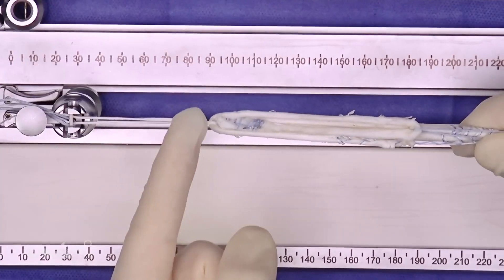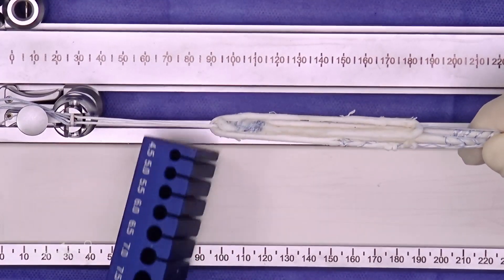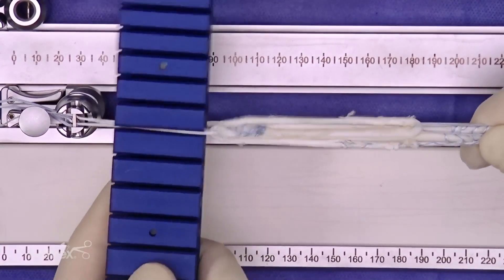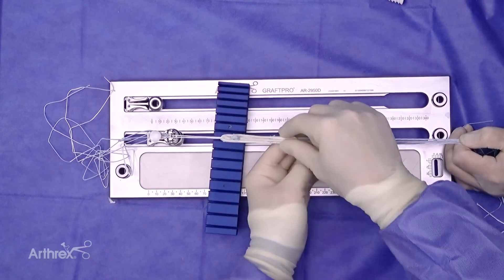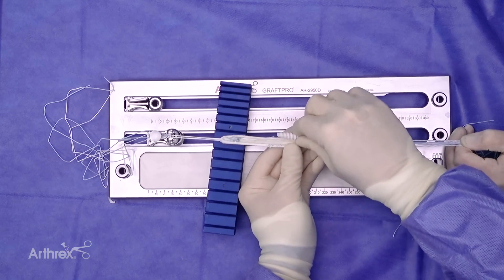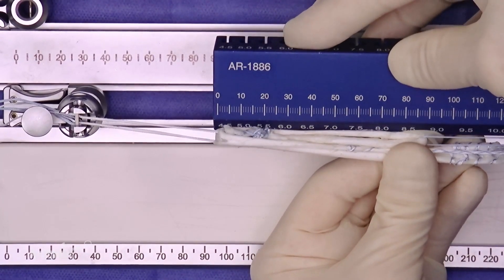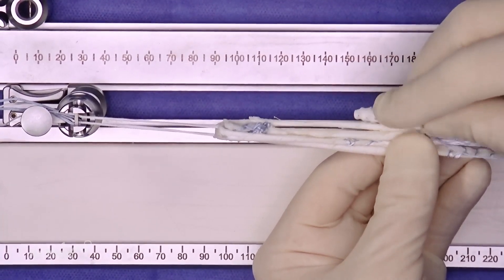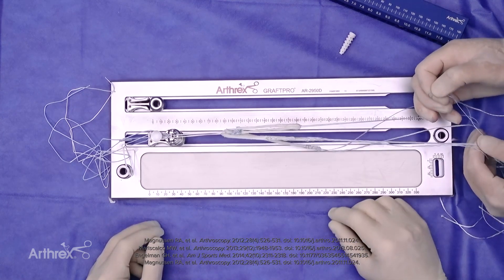This can then be sized. Our initial size was a seven; we have expanded from that. This is an eight and a half with good interference fit, and that is exactly what one would want with a hamstring autograft eight and a half millimeters in diameter without any hybrid fixation. Once this is done, final fixation can be interfaced with a screw. In this case, an absorbable biocomposite screw can be placed in a standard fashion, because the length with this construct is approximately 90 millimeters, with adequate length in the tibial tunnel to provide direct interference fixation, just like a standard quadruple hamstring. This completes your appropriate reconstruction in an all-autograft technique with low re-rupture rates and in a cost-effective fashion.